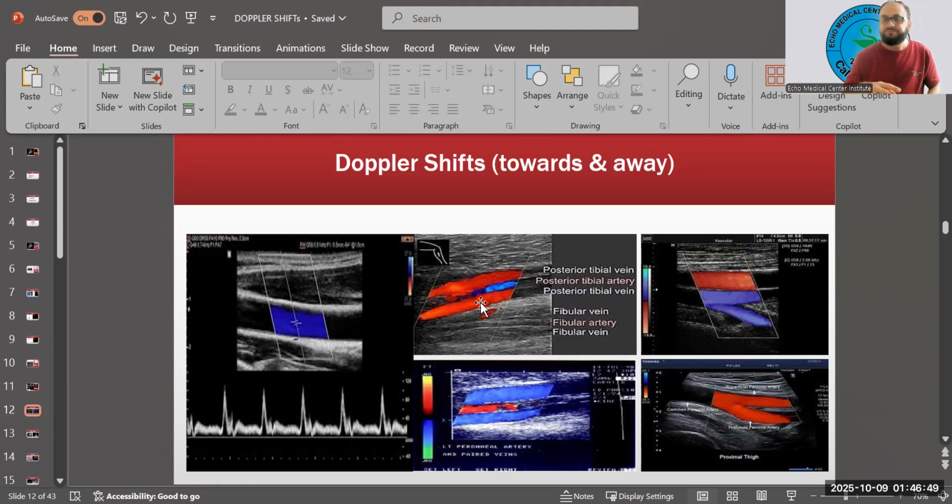Sometimes that invert button or knob in the machine is for this adjustment. So if they ask you this question in ARDMS, simply click the invert button and now you're good to go. Instead of representing this picture, you will represent this one, which is correct.